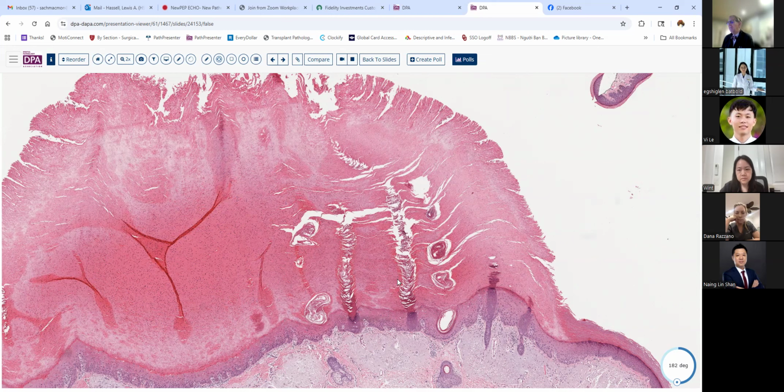No, but that's a good guess. So what's beneath these here? Do you see what the continuity is down here? Maybe the duct of the eccrine coil. Yes, yes. So these are adnexal sweat gland ducts or hair shafts, things like that.